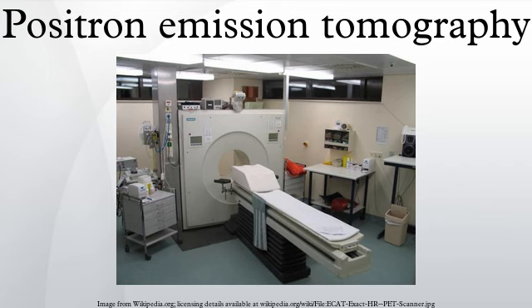At present, however, by far the most commonly used radiotracer in clinical PET scanning is fludeoxyglucose, an analogue of glucose that is labeled with fluorine-18. This radiotracer is used in essentially all scans for oncology and most scans in neurology, and thus makes up the large majority of all of the radiotracer used in PET and PET-CT scanning.